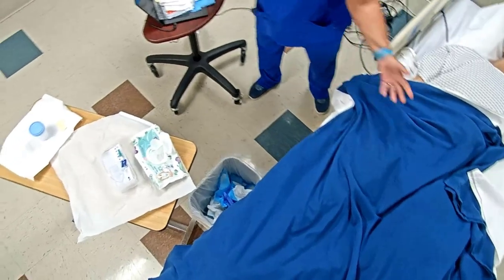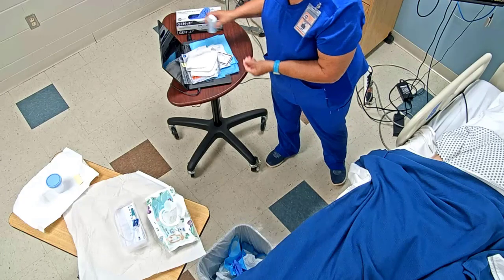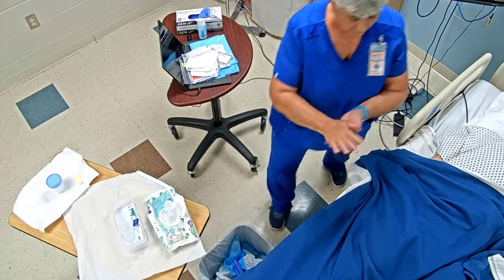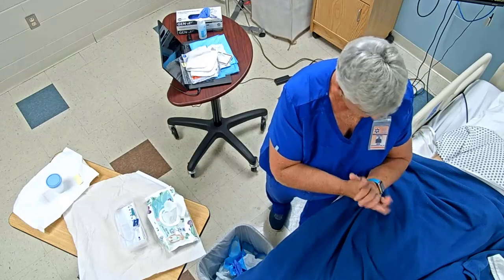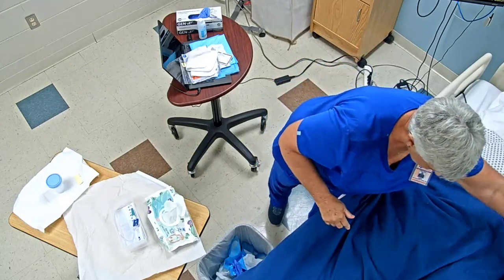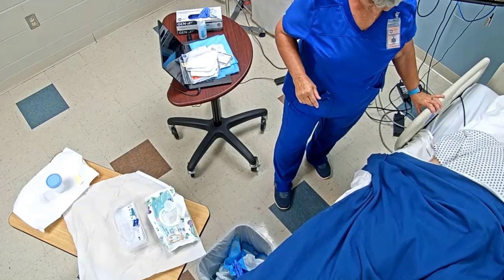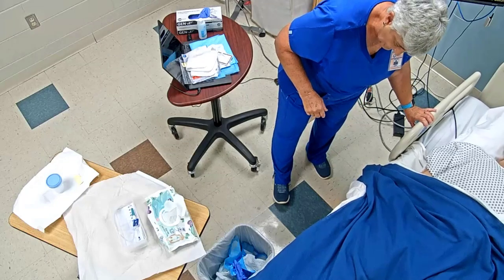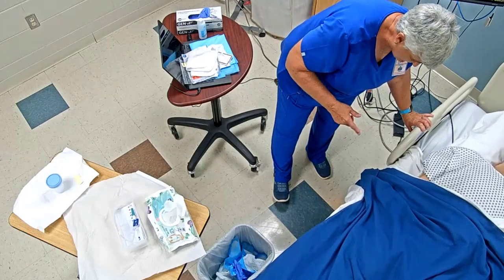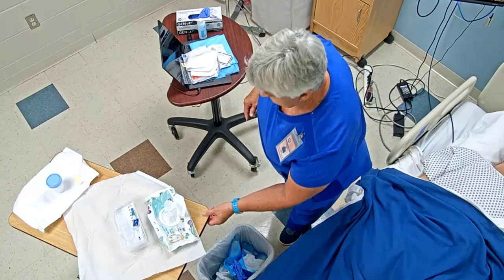If you felt like you needed to clean or change gloves between, but we were good with doing that. All right, I'm going to go ahead and get my bed back down. So my two side rails are up, bed's lowest, wheels are locked, my call light's within reach, okay?